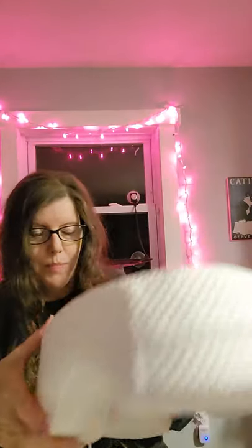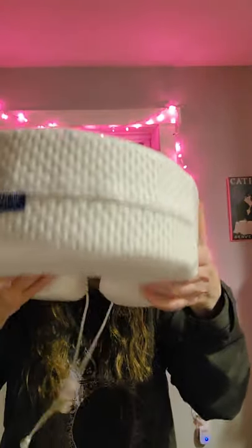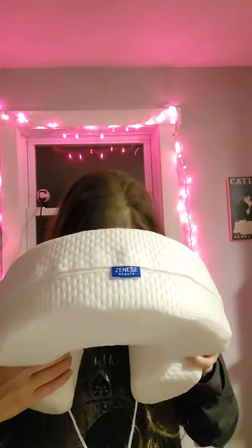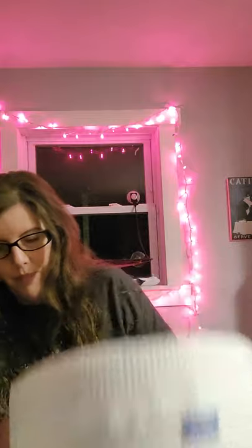There are strings to tighten it. Let me look at this instruction card here. So the bottom — this is for airflow underneath the pillow, so you're not suffocating. The sides here are soft where the airflow goes in.